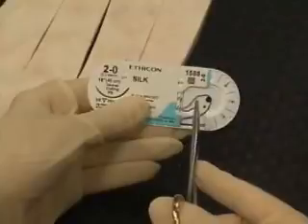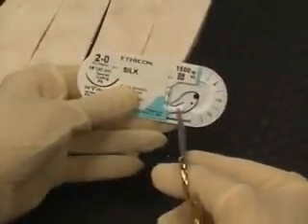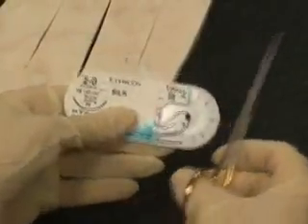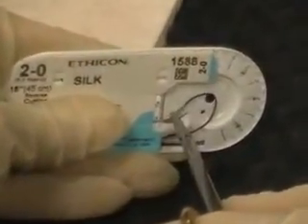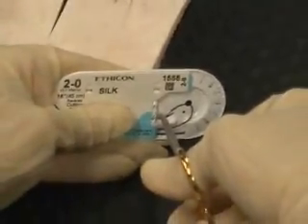But in general, a good way to at least start to load your needle is, and I'm holding this up for the purposes of videotaping, but the best way would be as if this were lying flat and you'd actually come straight down onto the needle. It's very stable. So we're going to hold this up so that you can see, and basically if you come straight down, you're holding the instrument as if you're shaking hands with an instrument.